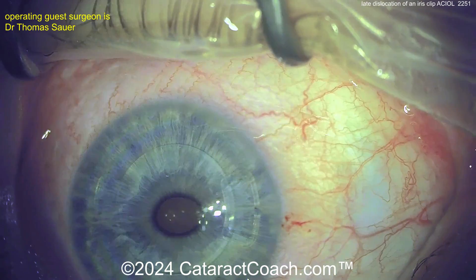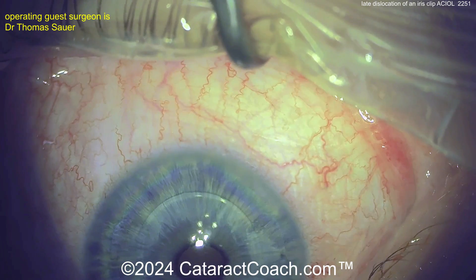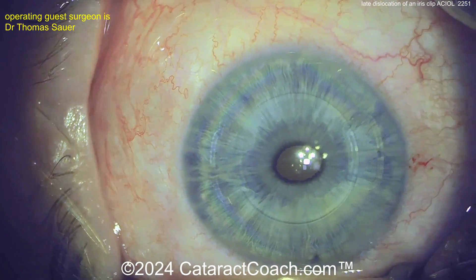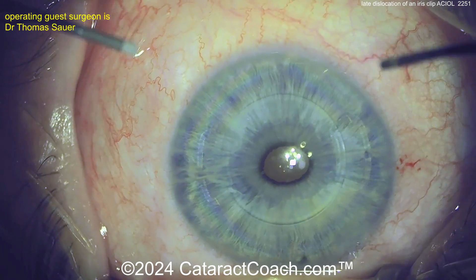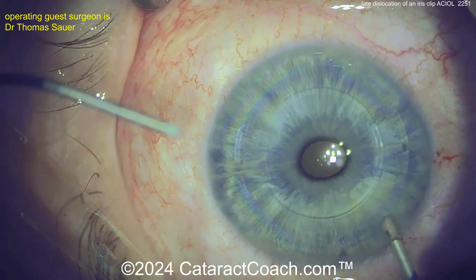Neat technique — always fun to see new instruments and new toys. At the end of the case, obviously just remove the viscoelastic, seal up the incisions, and call it a day. You can see on the bottom part of the screen the patient has a small peripheral iridotomy, which is important with these types of AC IOLs that are blocking flow of aqueous through the pupil.